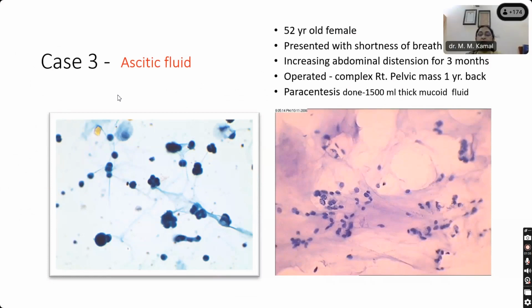Yes, that's very true. And by and large, leaving apart primary effusion lymphoma, lymphoma or leukemia are generally diagnosed previously, clinically. So it's not a very difficult diagnosis when you start getting these mononuclear cells.